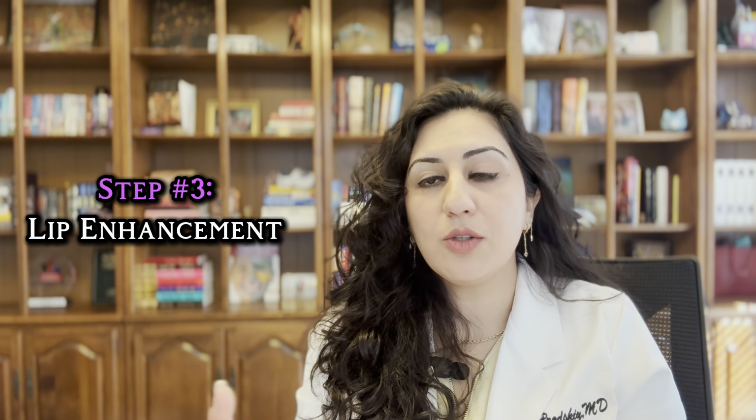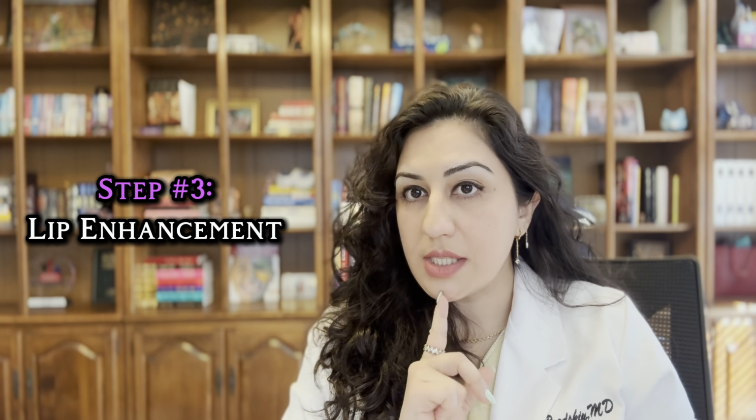Why do we have to take a look at the lips? Well, we've adjusted the chin. So because we've adjusted the chin, it's going to change kind of this ratio that we have between the nose, the chin, and the lips. And it's important that we achieve the right angle between these 3 things. If the chin protrudes too much as compared to the lips to the nose, that ratio throws people's proportion off, and in a profile view, it is less ideal.